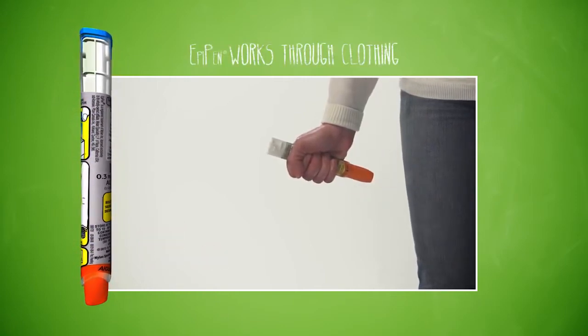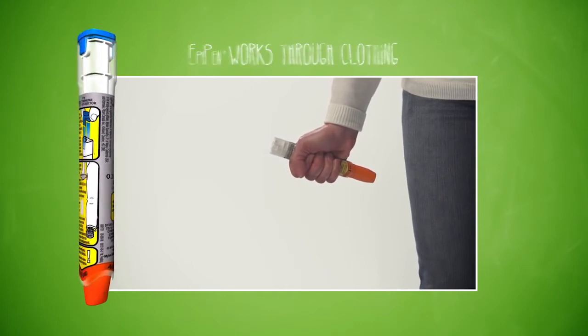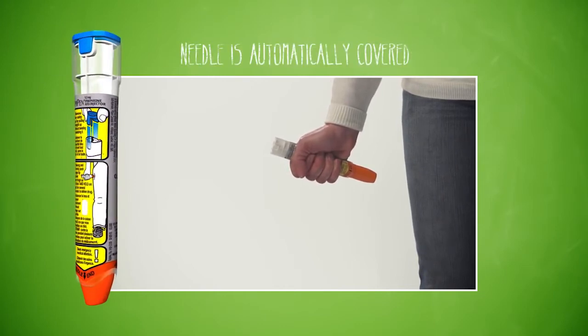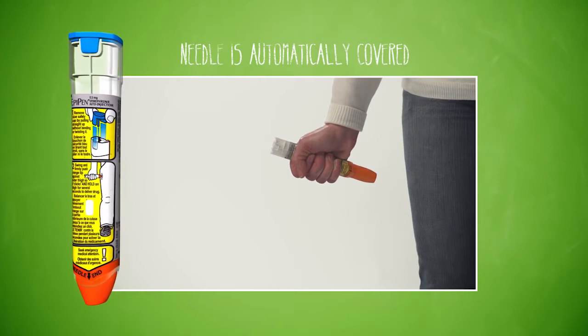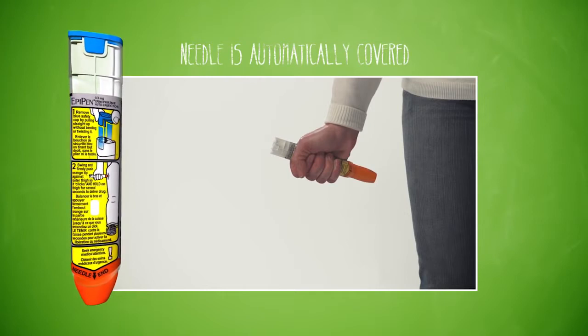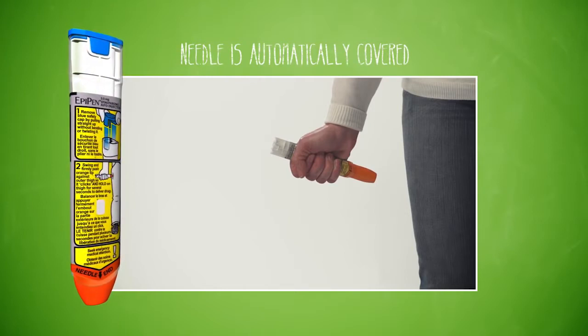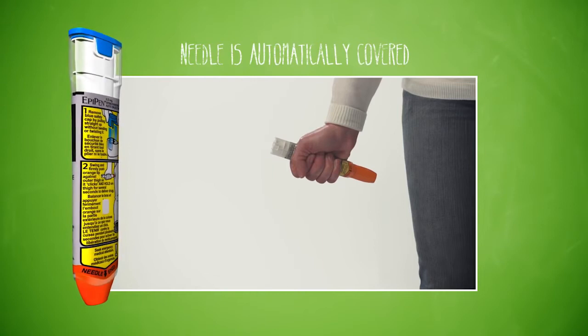EpiPen will work through clothing if necessary. After EpiPen is used, the orange needle cover will automatically extend to cover the needle. This safely covers the needle as the auto-injector is pulled away from your thigh.